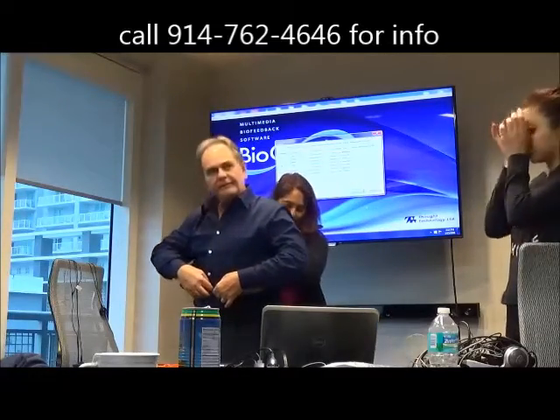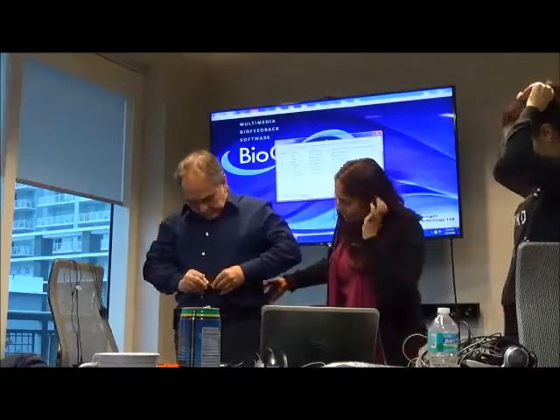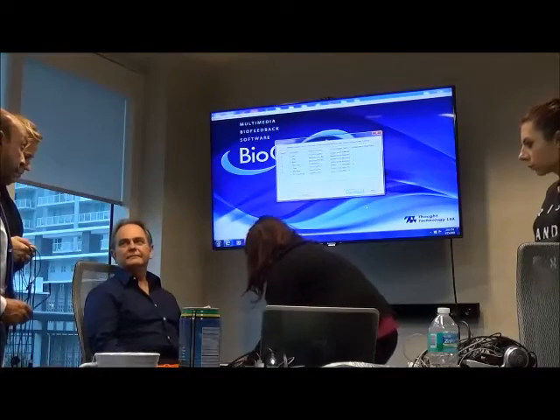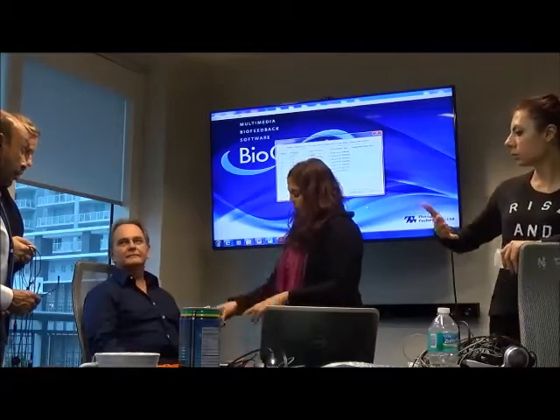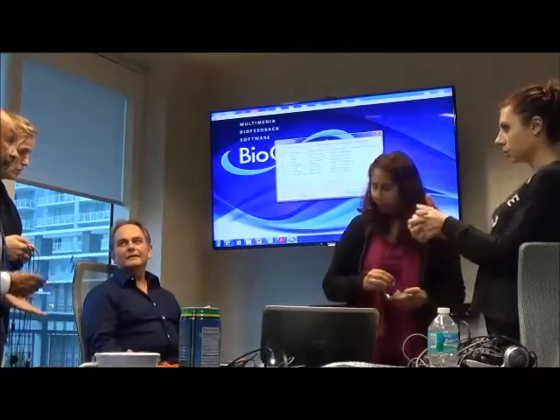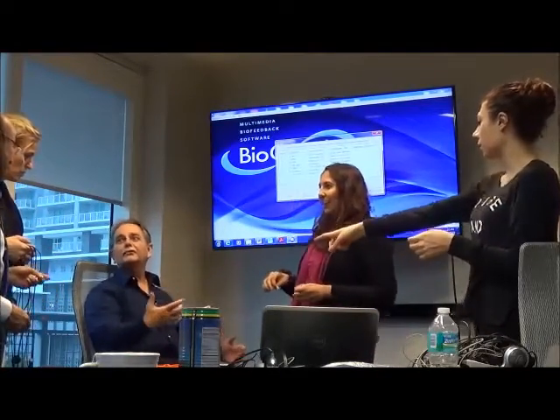And with this, they have an add-on piece that if you need more length, you can. Where are you going to put the sensor? On his right hand. Did you test? On this one. In the left hand. The test. Sorry. Yeah, we did the test yesterday. She knows already, yeah.